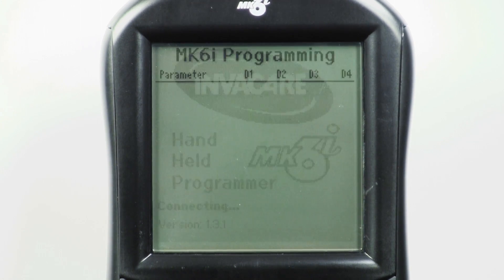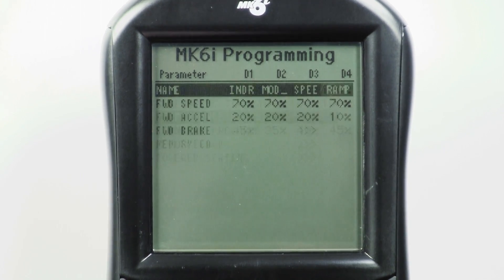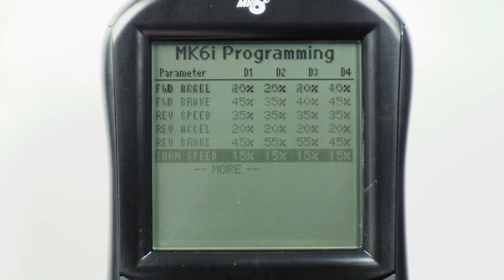To enable RIM, or three-quadrant driving, plug the programmer into the chair, turn on the chair, then turn on the programmer. Scroll down to Performance Adjustment and press Select. Now scroll down to RIM, which is pretty far down the list.